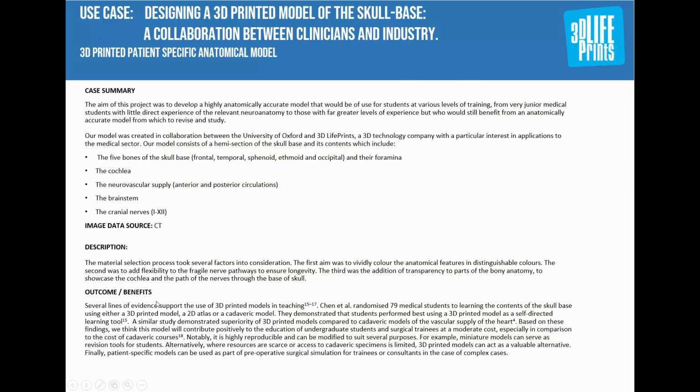Interestingly, there have been several lines of evidence. Again, we always like to talk about the evidence for what we do, about the evidence that supports the use of 3D printed models in teaching, showing that medical students who have had the opportunity to learn using 3D models in addition to cadaveric models show positive results. And as we can see here, 3D models can act as valuable alternatives or can obviously be used in conjunction to existing cadaveric teaching and existing anatomical teaching.